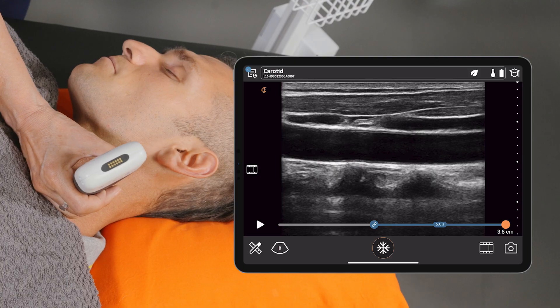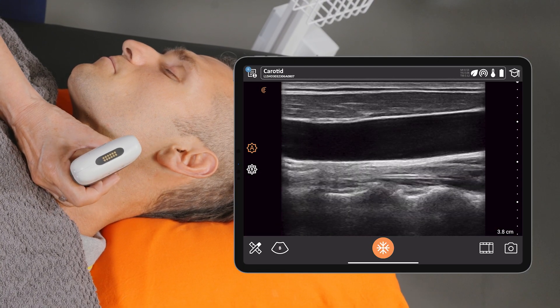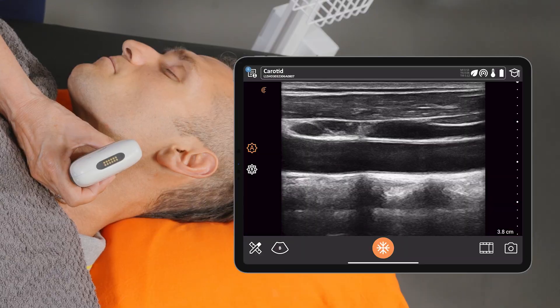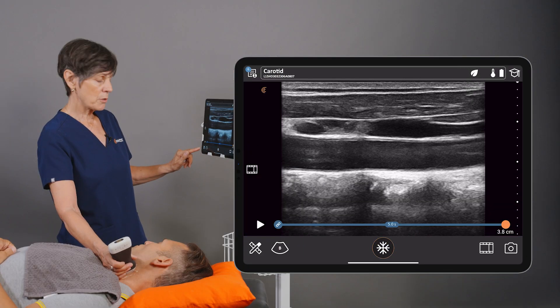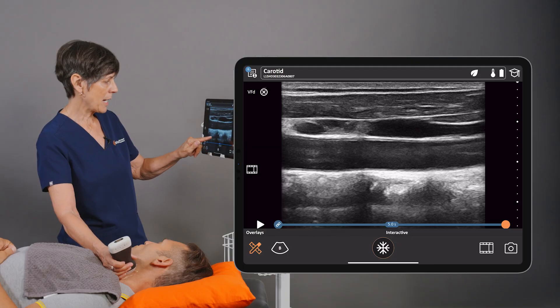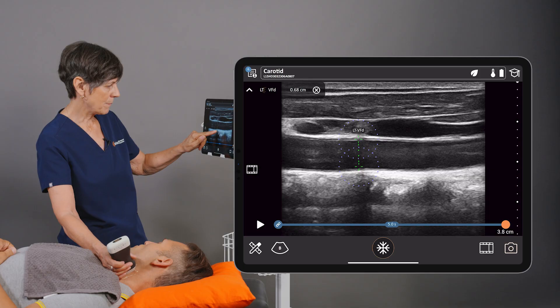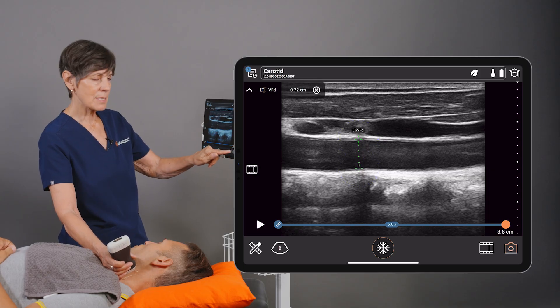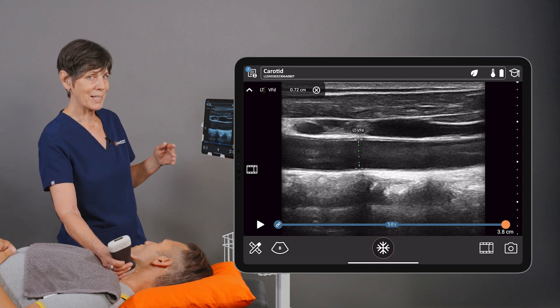I'm going to place my scanner over the carotid. We'll center our vessel and freeze it, then enter into the tools menu and measure the volume flow diameter. I'll adjust my calipers slightly, and then save this image by taking a picture, which will also save the measurement for the calculation.